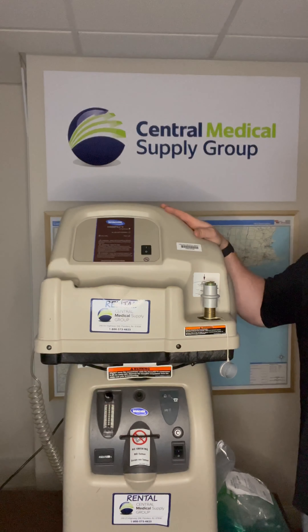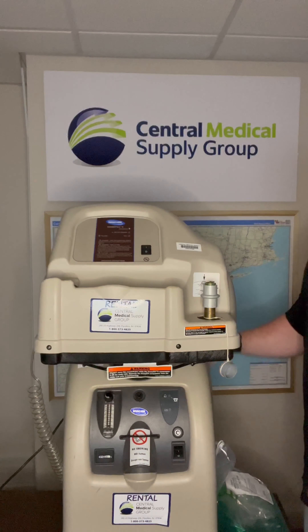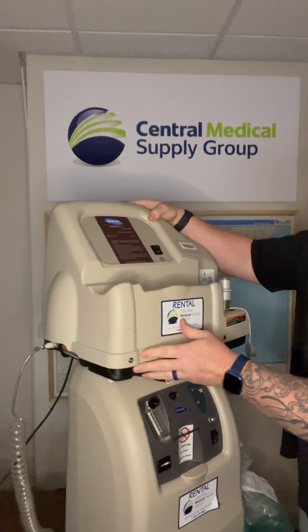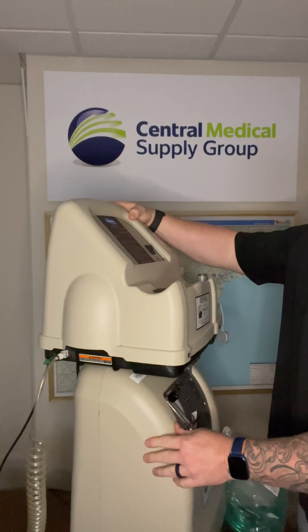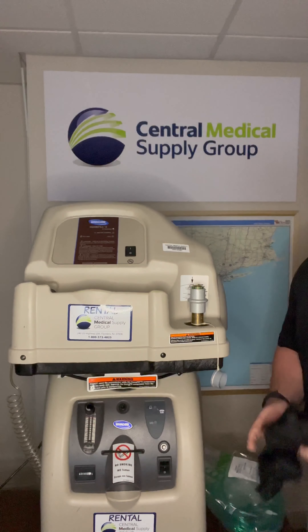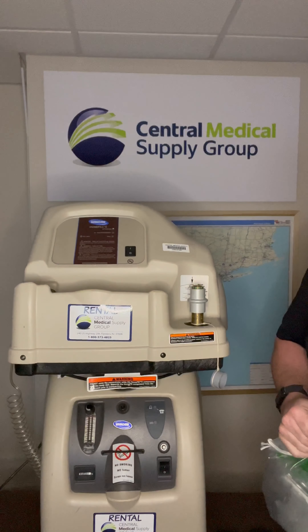When dealing with the home fill operating system, these are the components that you're going to make sure that you have: your oxygen concentrator that is compatible with the home fill, your home fill compressor with a ready rack platform, your coiled interconnect oxygen supply line that connects to the home fill compressor as well as the concentrator, two home fill system oxygen tanks, one oxygen tank shoulder carry bag, and your standard oxygen patient kit.